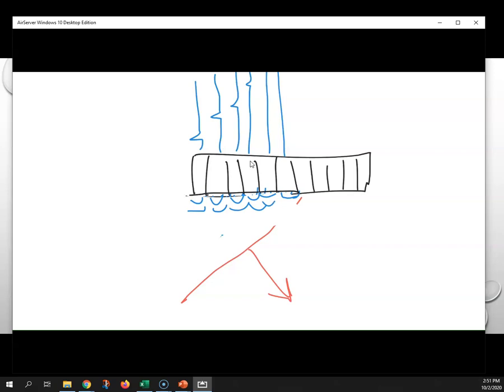And those delays, these little timing delays that you see here, are called phasing. So phasing occurs and we get a wavefront that is created utilizing Huygens principle, and that steers our wave in a direction.